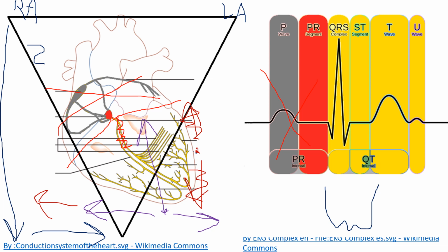What I do know is that if the QRS is positive, the T wave will be positive, because these typically go in the same direction unless something really goofy is going on. But yeah, you're going to produce a wide, bizarre looking QRS, and your T wave is also going to be kind of bizarre looking. All right, well, I hope that helps out, and good luck.